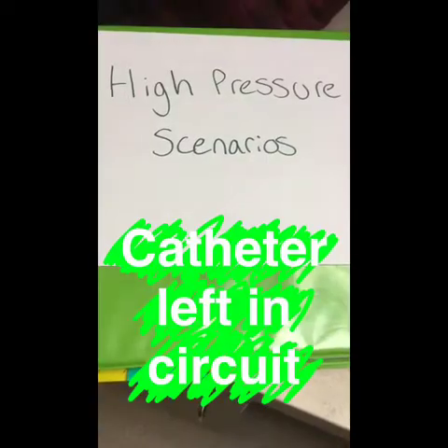Mucus plugs large enough to totally occlude the patient's airway need to be addressed immediately. If you can't dislodge it, the ET tube may have to be pulled and the patient might have to be reintubated. Of course, we want to do everything to avoid this, as this is our last resort.